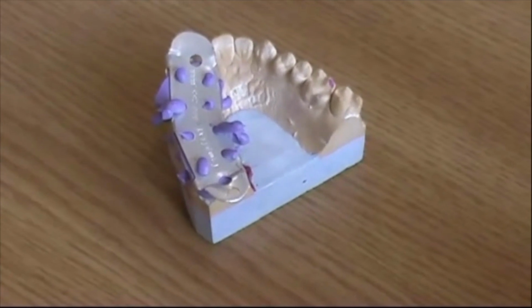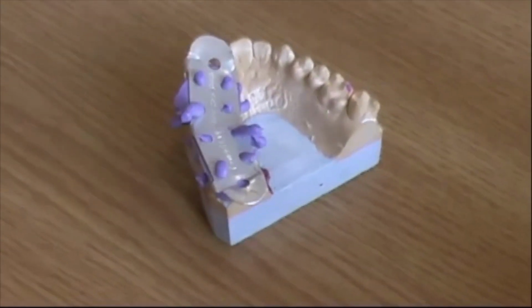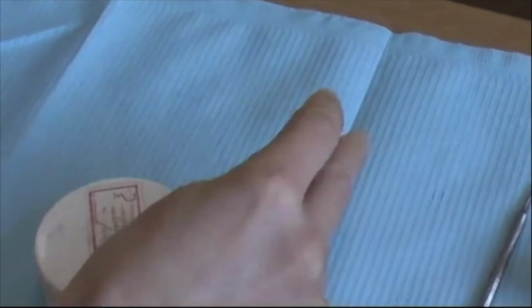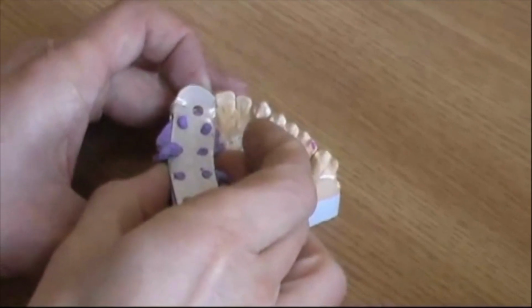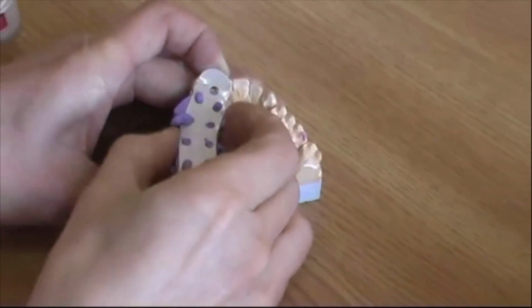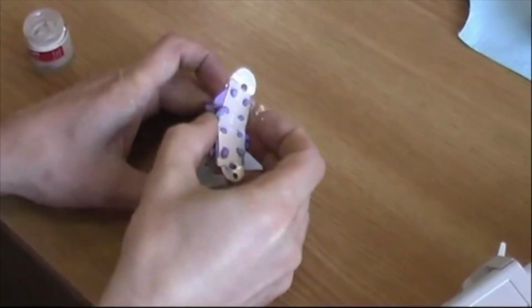And your time is important, because you do this in the mouth and you don't have time. The next patient's at the door. Time is money in dentistry, so please remember that. And now the 30 seconds is set. You just take it away. You have your index in a tray. That means the margins of the index aren't flexible. Take it off.